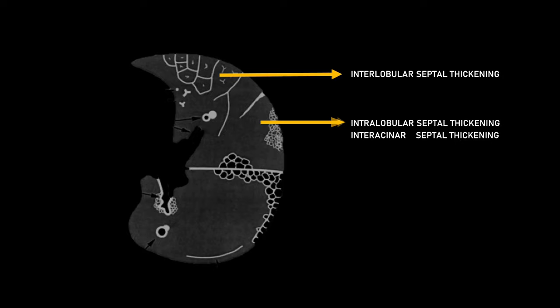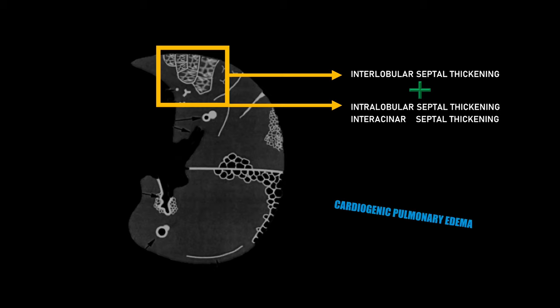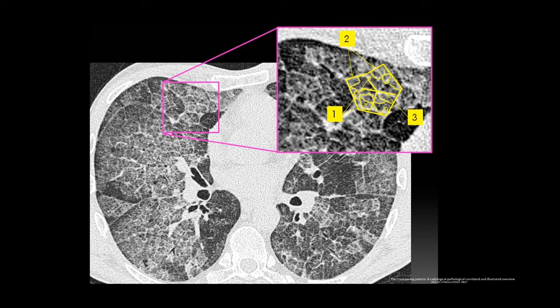In this example, we can see the interlobular septal thickening and now the intralobular septal thickening together. This is another representation of the first phase of the cardiogenic pulmonary edema, also called the interstitial phase. In this real patient, we can see interlobular septal thickening and intralobular septal thickening.